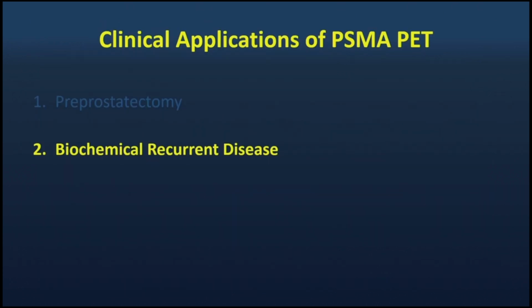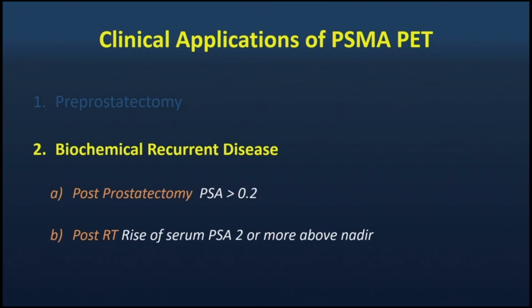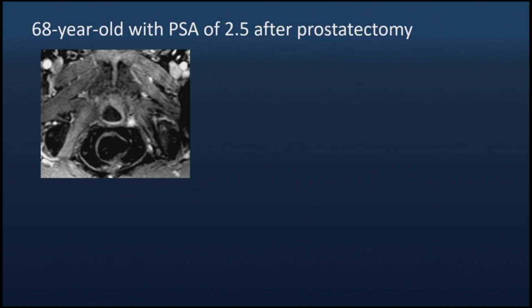So moving on to the biochemical recurrence groups. This one we do a ton of at UCSF, and we do it very often longitudinally. Patients will go through definitive therapy. They'll come back and they'll be re-imaged again. Here's an example. Again, I don't know why my examples are all on the left side. What we're looking for in the prostate MRs is areas of abnormal enhancement. You can see this would be the one that we want to see as a radiologist, clearly an area of abnormal enhancement in the left prostate bed.